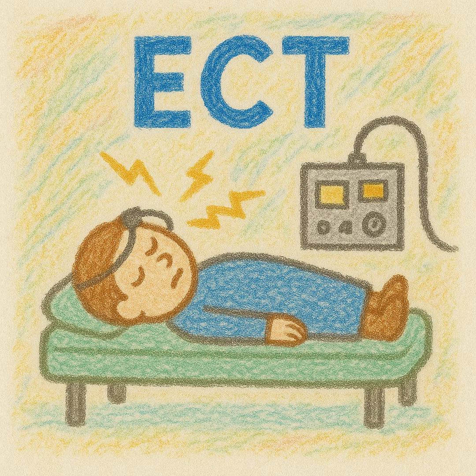The reason why we put the tourniquet on the right foot is because if we're doing right unilateral, then we want to see that the seizure has generalized from the right side of the brain to the left side of the brain, and the left side of the brain controls the right side of the body. So if you tourniquet the right ankle and you're doing right unilateral and you see that the foot is moving, then you know that the seizure has generalized to the left.